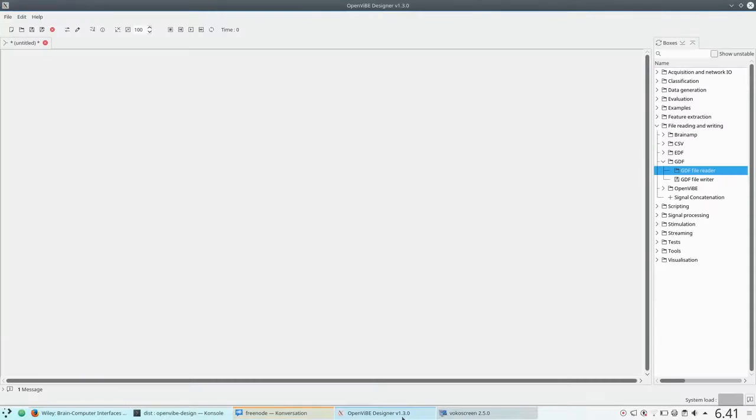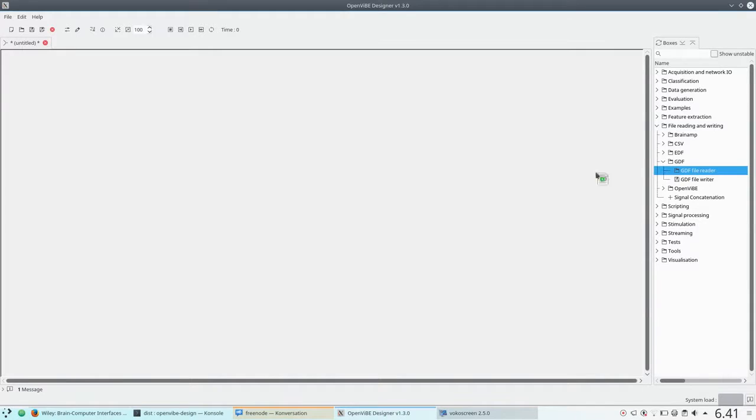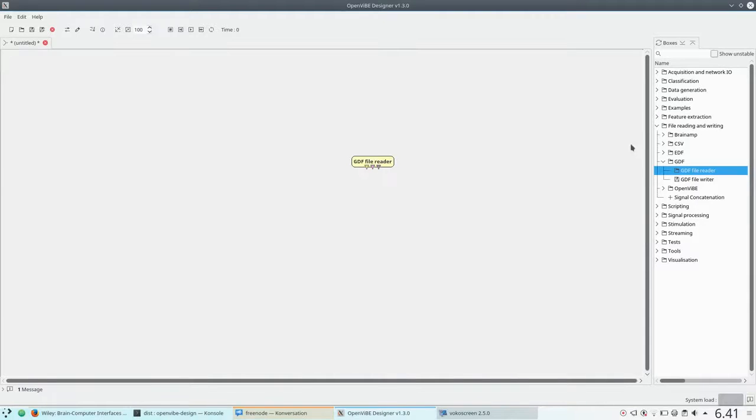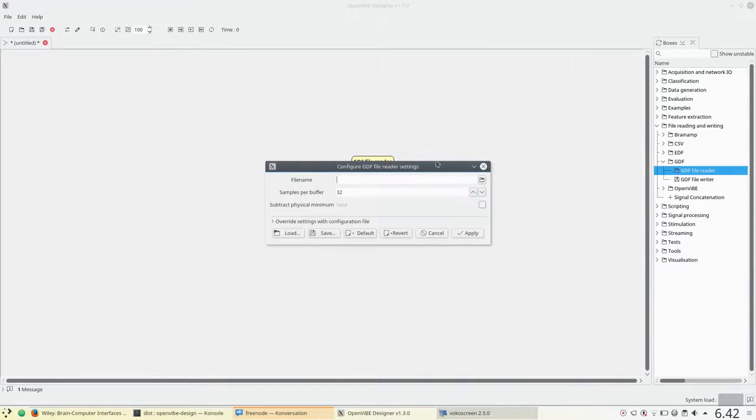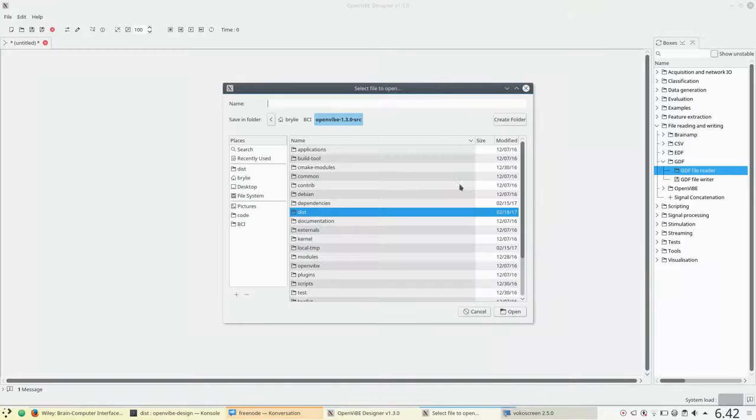So we'll go over to OpenVibe, and the data is in a format called GDF. It's under file reading and writing, and basically they're text files.